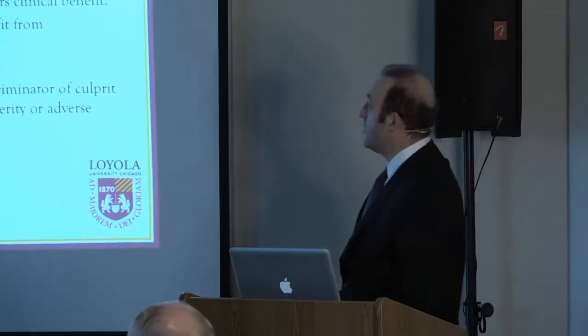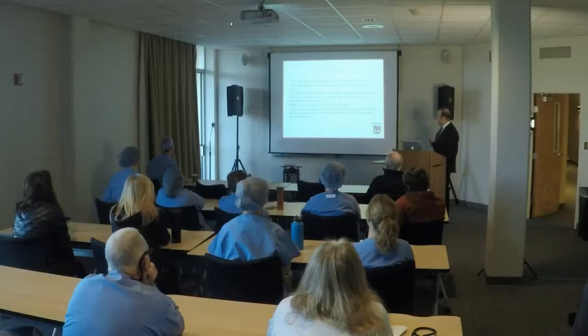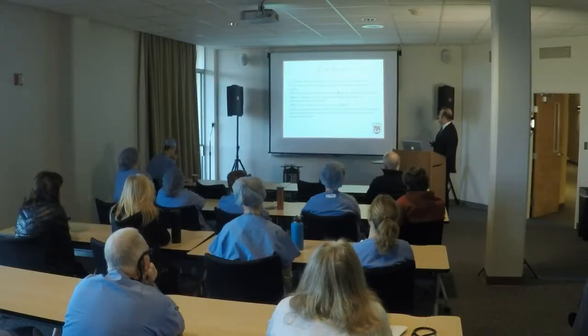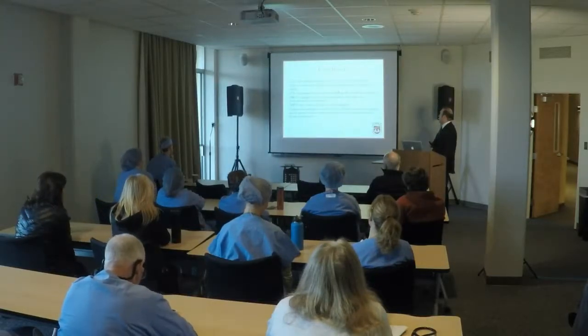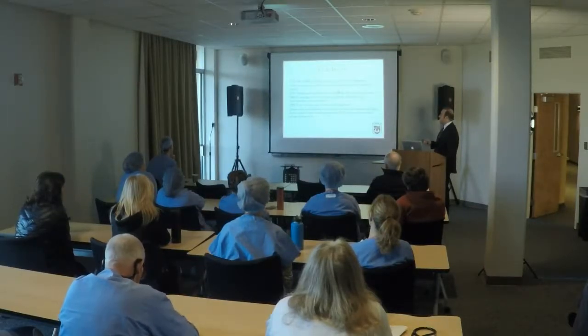So in conclusion, CTA offers excellent diagnostic accuracy as well as prognostication. It's safe and can be utilized as an acceptable alternative to functional stress testing. CTA findings guide therapeutic decision-making that confers clinical benefit. And FFRCT sheds light on which lesions as well as patients will benefit from revascularization beyond stenosis. And we've demonstrated that FFRCT can safely avoid unnecessary invasive angiograms.